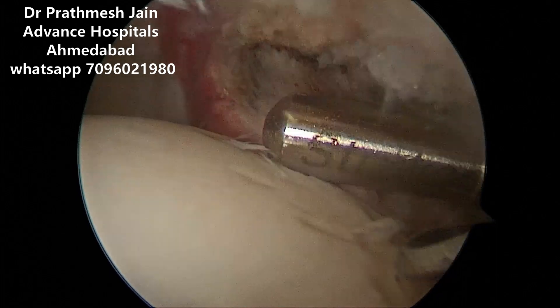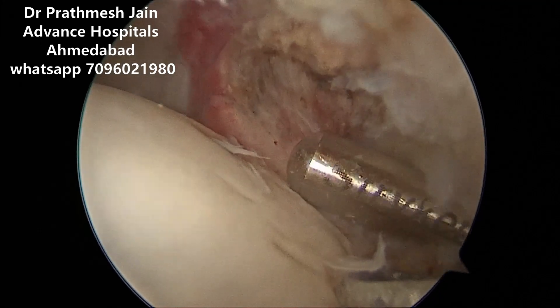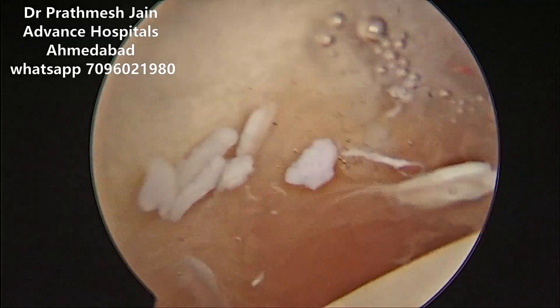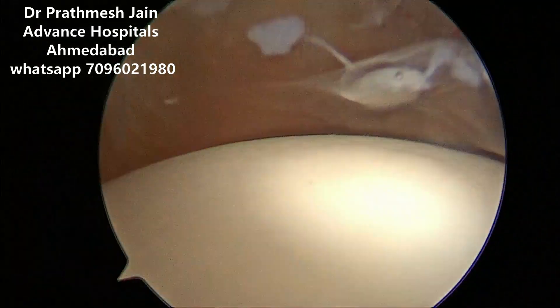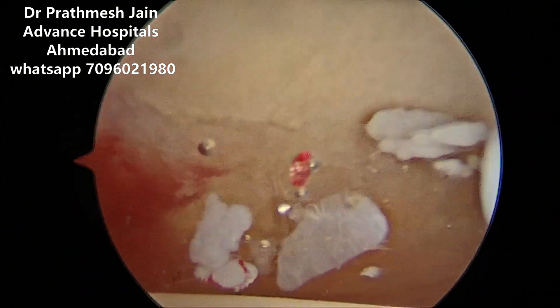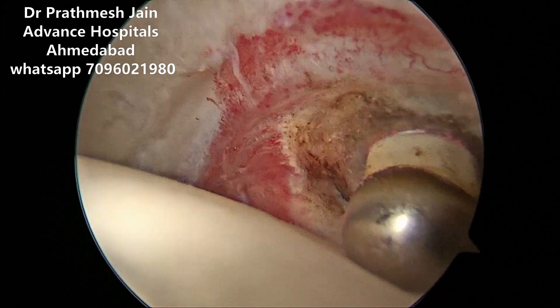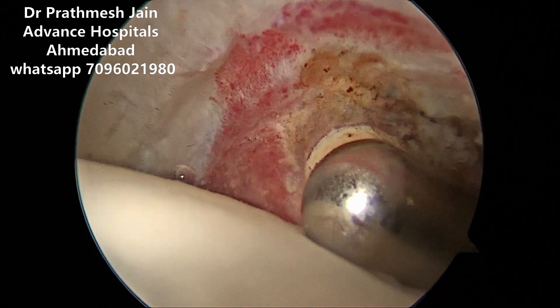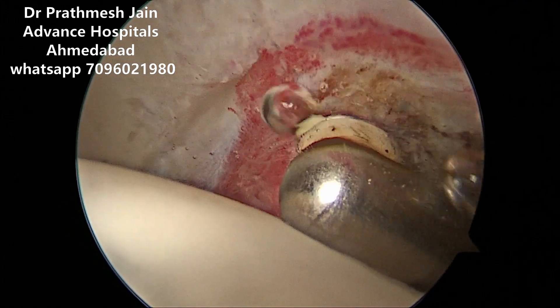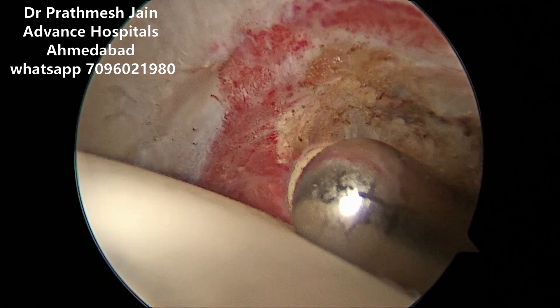This capsulotomy will make your surgery easier because the hip will become lax, and it is also a therapeutic measure because it will release and decrease the pain. You can see that apart from the femoroacetabular impingement, there is a little bit of chondral flakes inside the hip joint, which is suggestive of some sort of synovial chondromatosis. The capsulotomy is increased and extended on the lateral aspect of the hip, which will make our work much easier.